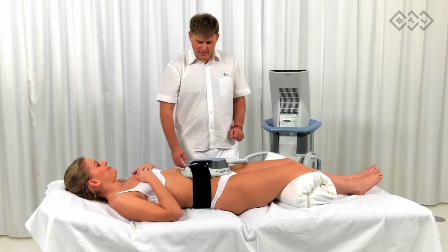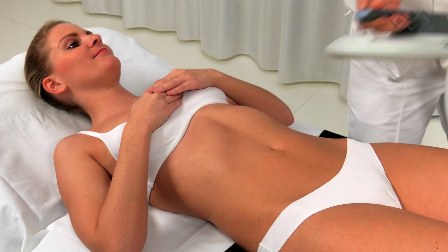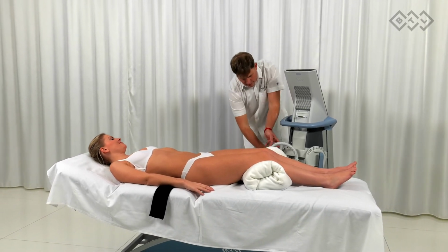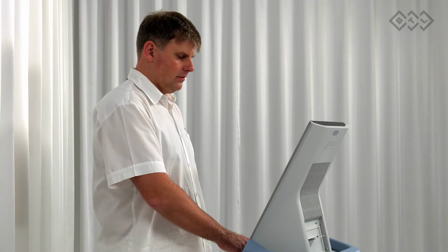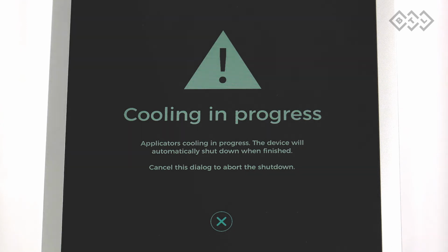Remove the applicator when therapy is completed. The patient may feel mild muscle fatigue after the treatment. The device will automatically cool down both the system and applicators after the completion of the treatment. Never unplug the device during the cool down process.